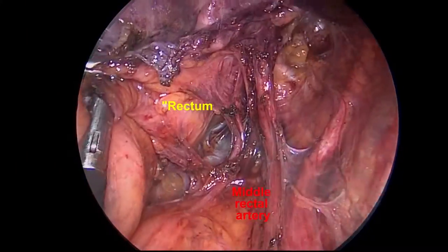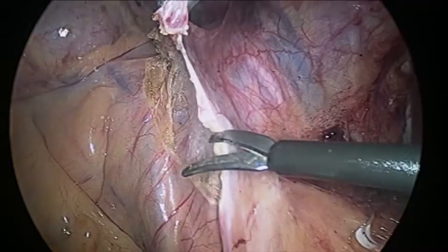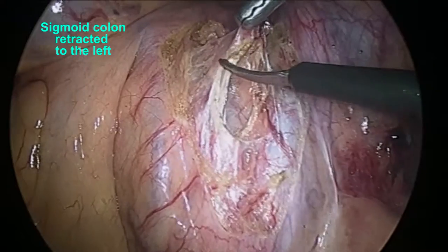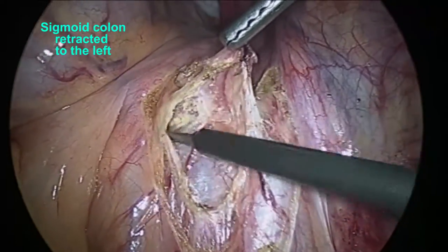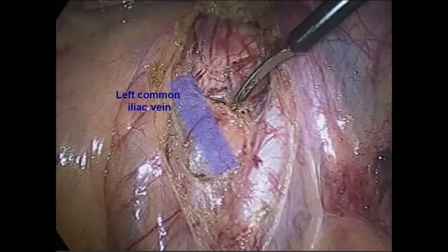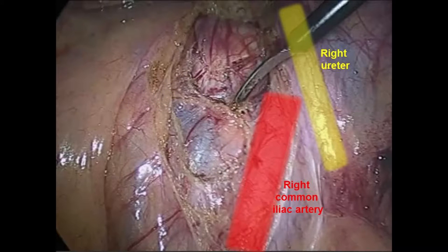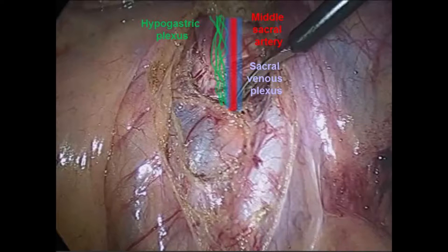The presacral or retrorectal space is located between the rectum and sacrum. To enter the presacral space, the peritoneum overlying the sacral promontory is tented upward and monopolar energy is used to make a vertical incision. For optimal exposure, the sigmoid colon should be retracted to the left, which may require a stitch through the epiploic appendices anchored to the anterior abdominal wall in the left upper quadrant. The connective tissue is brushed away using a gentle sweeping motion directed posteriorly and caudally. The left common iliac vein forms the left border of the presacral space. The right common iliac artery and ureter form the right border. The hypogastric plexus, middle sacral artery and vein, and sacrovenous plexus can be found in the center.